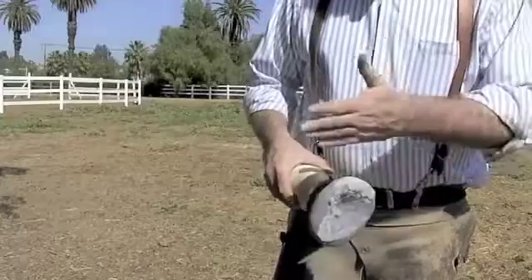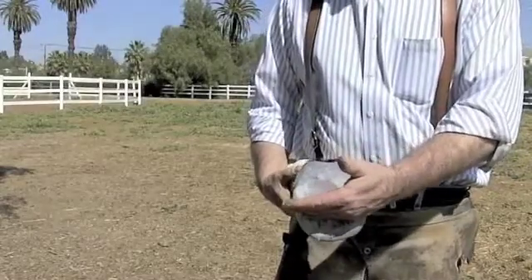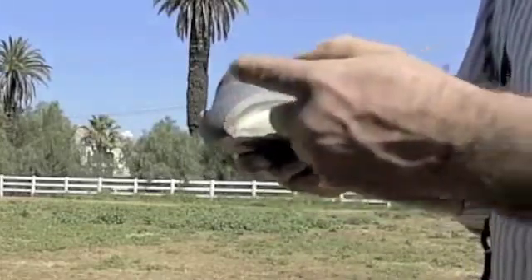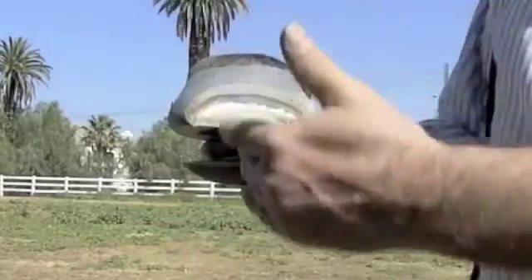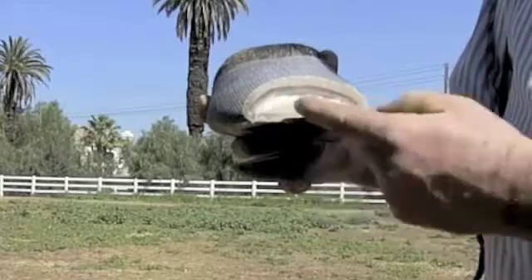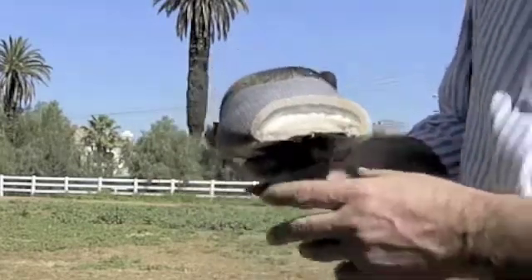We've added an extension onto this foot and now we're going to cut medial-lateral slices to see how accurately we were able to read the foot using landmarks on the hoof — especially the collateral grooves. Looking at the first section, we're doing a series of cuts going medial to lateral to see where we are in balance. What we're most concerned with is getting the hoof into the center of the bony column. You can see the overabundance of hoof on one side and the lack of hoof on the other — hence the need for the lateral extension.